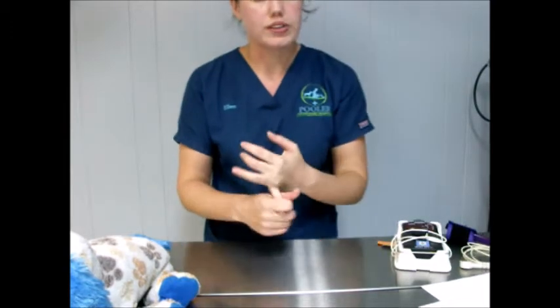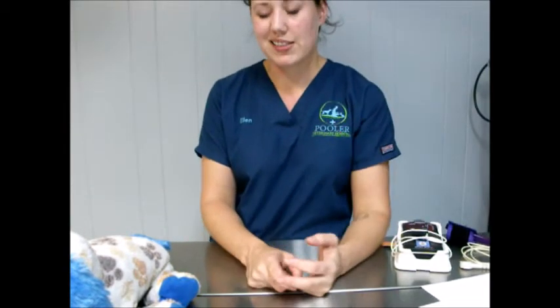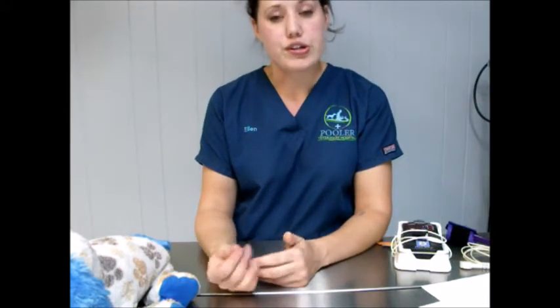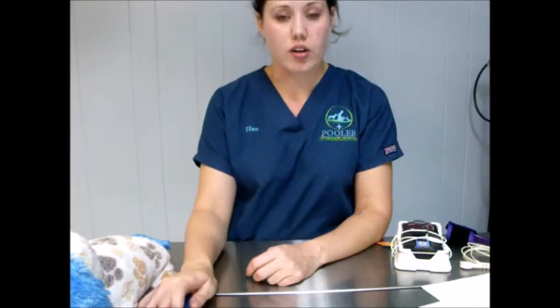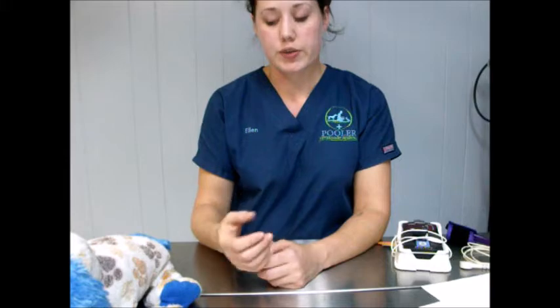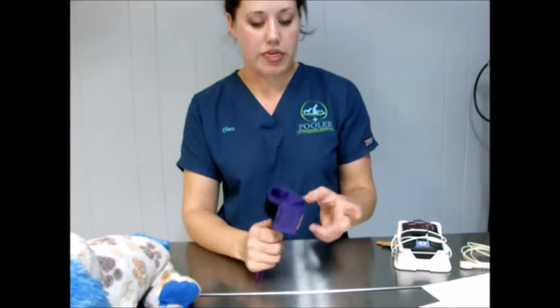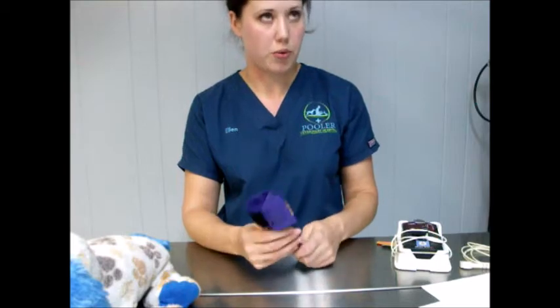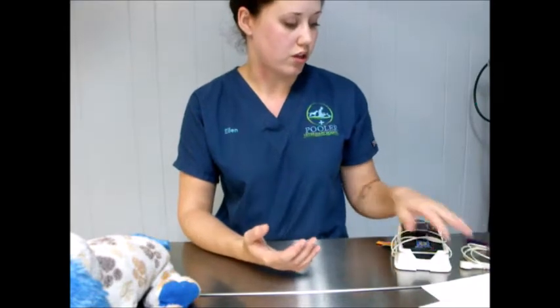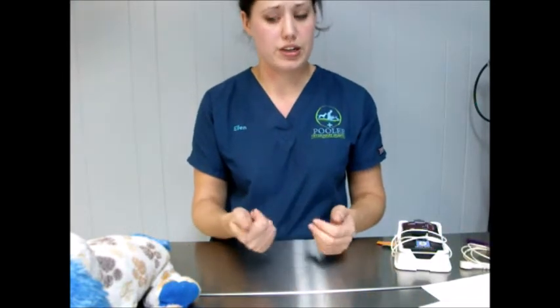So next we have pulse and blood pressure. Pulse is something you want to check obviously, but it's not as accurate as checking blood pressure. Of course, check pulse by checking any of the peripheral arteries. You want to make sure that it matches up with the heart rate as well. Blood pressure, we measure either with the cuff and the sphygmomanometer or the Doppler. With the Doppler, of course, you have to listen for that whooshing sound.